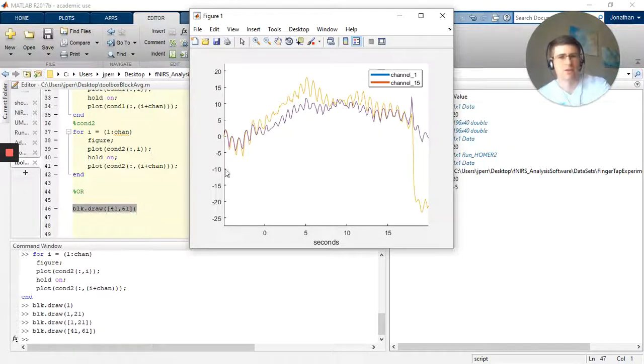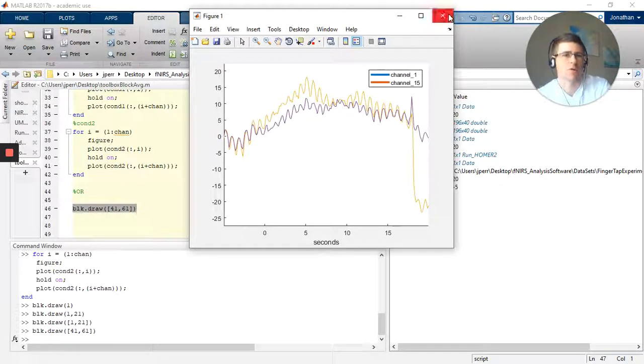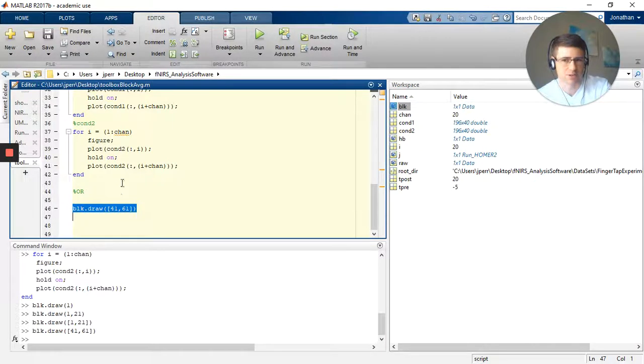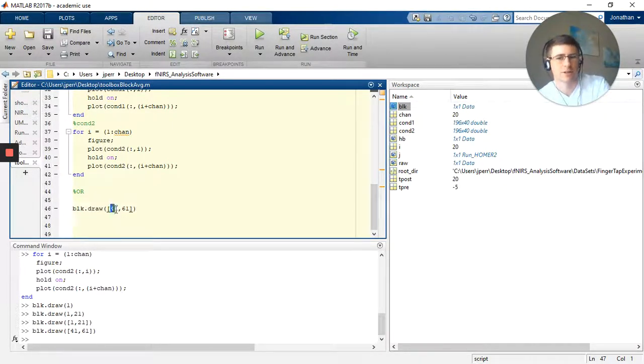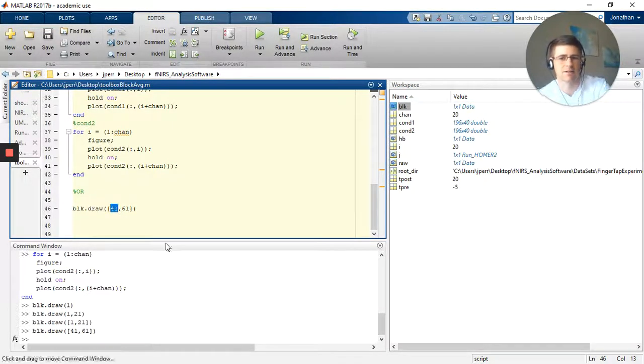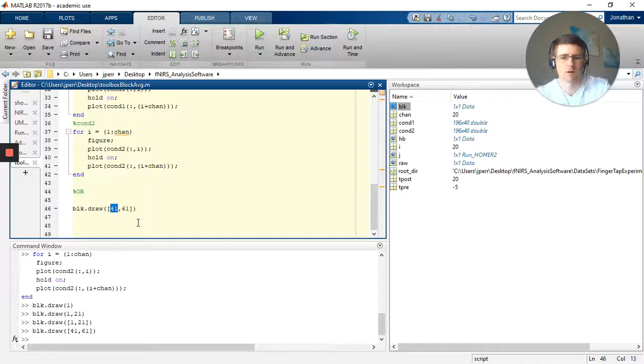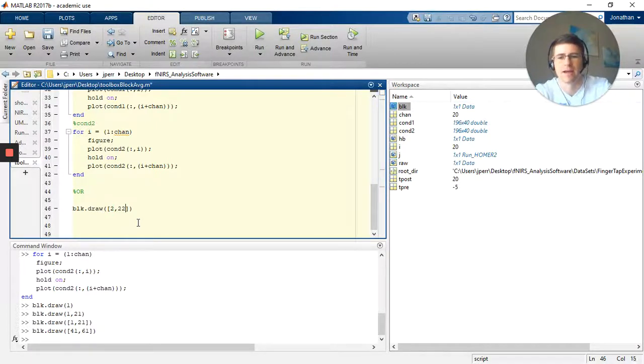You go from channel 1 through 40 being condition one, and then channels 41 through 80 being condition two. So at that point you could run a for loop on that, similar to how we did here, or you can just select the channels that you want one by one.